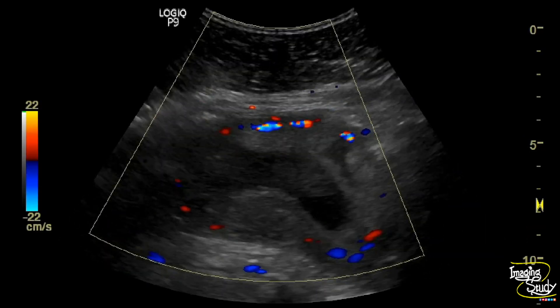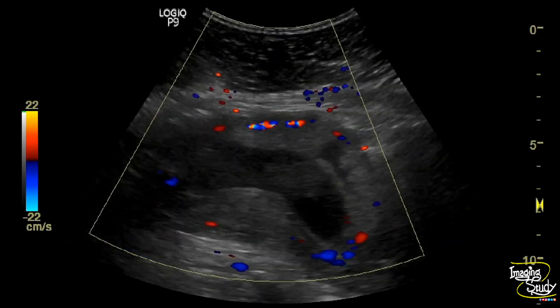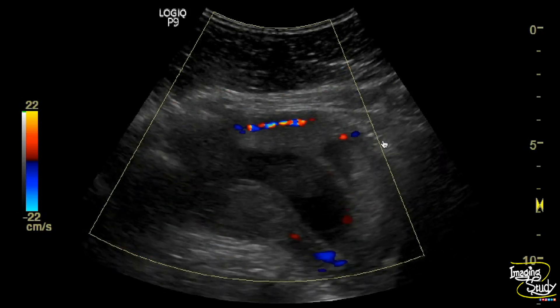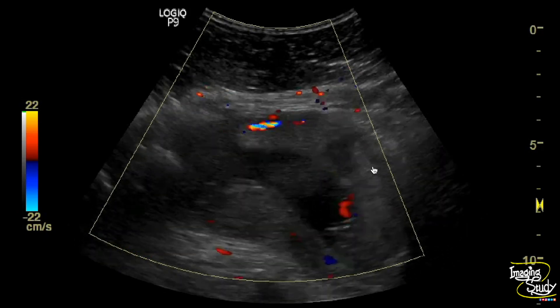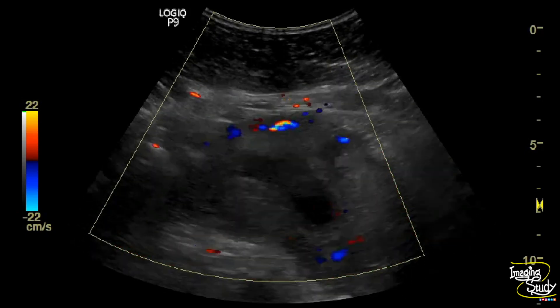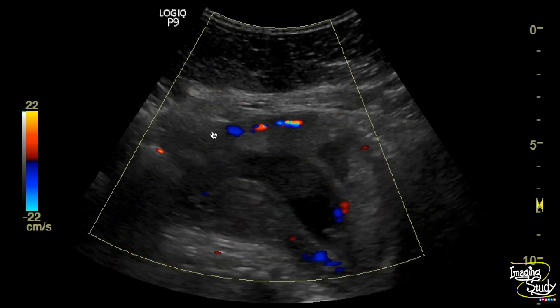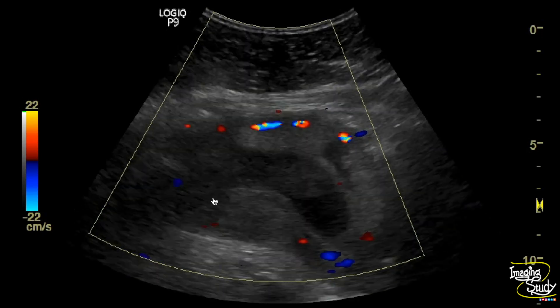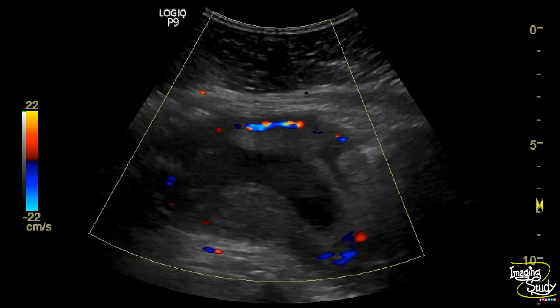Here we have applied color Doppler to exclude any other differential diagnosis like a mass. There is no vascularity within this hematoma. Adjacent normal retroplacental blood vessels are seen.